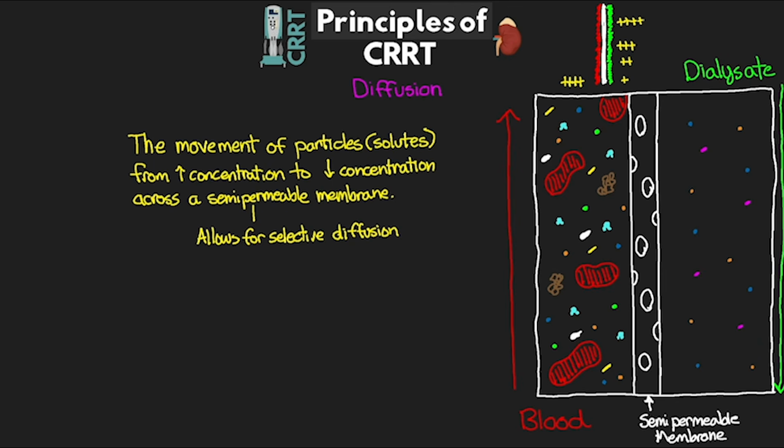Whereas if we have the dialysate flowing in the opposite direction of the blood, when that blood reaches the end of the filter and it has a lower amount of solute concentration, instead of having a dialysate with a high concentration of solutes like we see in the example here, we're going to have it interacting with dialysate with a very low concentration, still giving us that concentration gradient, and as it continues to move down, we still remain with a lower concentration than what's in the blood. And so thus, by having this countercurrent flow, we can get the maximum amount of solute clearance through diffusion.